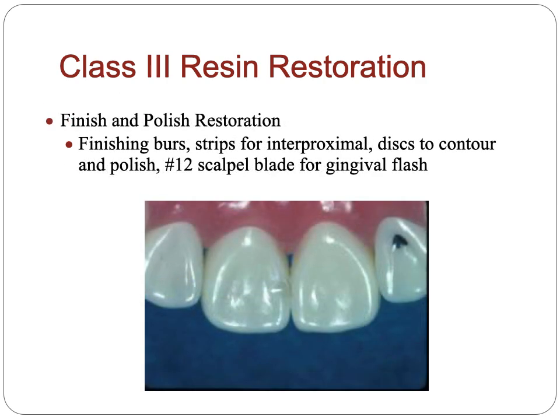After that, we will finish and polish the restoration, and you have different kinds of burs for finishing. You have strips for the interproximal area, you have the discs, and also you can use the scalpel. All of those will be explained in the lab.